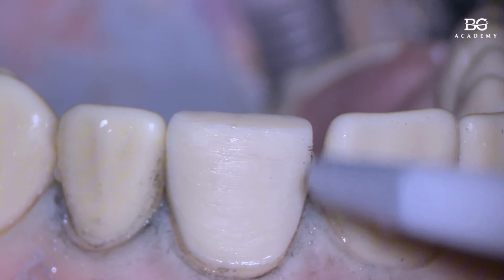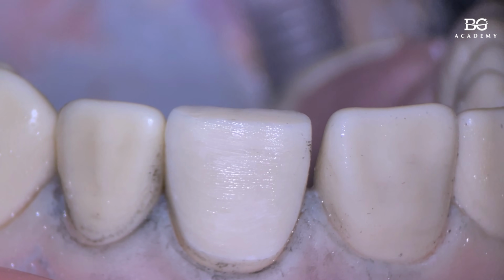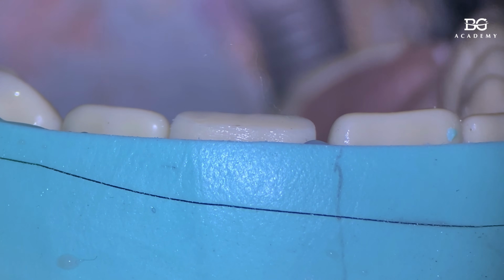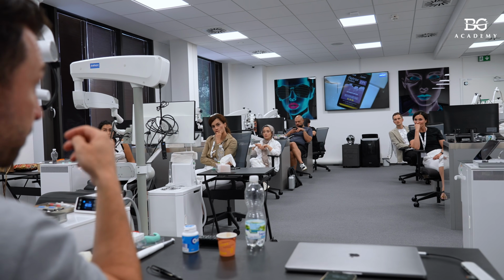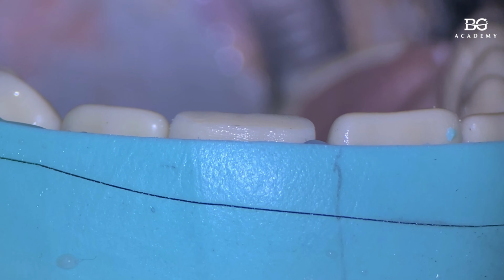Initial space for the restoration is created. You can check it with a silicone index. By the way, you can place your silicone index just to see what's going on there. Ideally, by the way, what is ideal for us at this stage is to have a bit of under-preparation, because that will be step 2. And during step 2, you also do some prep, some reduction.